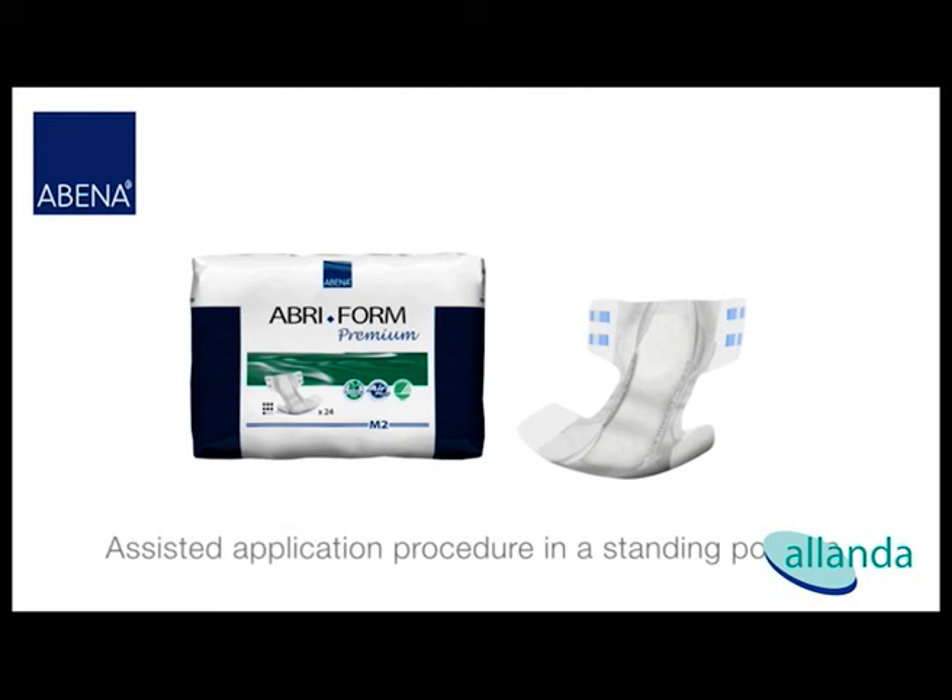This video describes the application procedure with assistance for an Abri-Form premium. Make sure that you choose the right size and that the absorbency is suitable for your incontinence level.